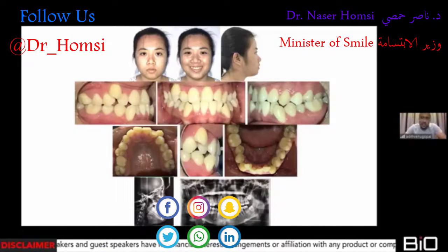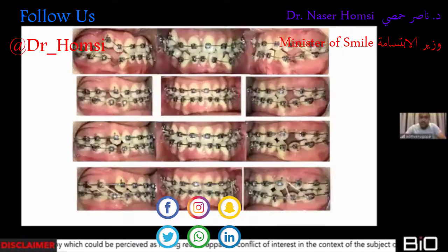Now let's go on to another case of heavy crowding, and I'm going to be showing you how I have corrected this case. This case was treated with self-ligation, and a similar crowding was corrected with conventional brackets. And I have used the same mechanics. There is no Damon mechanics used here.